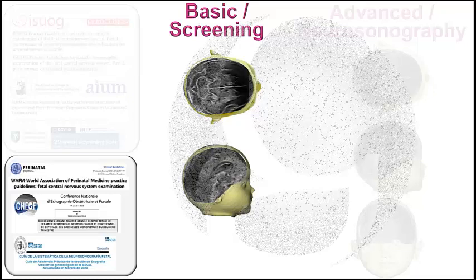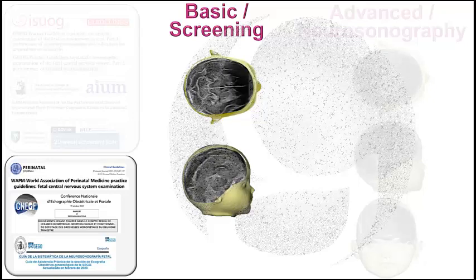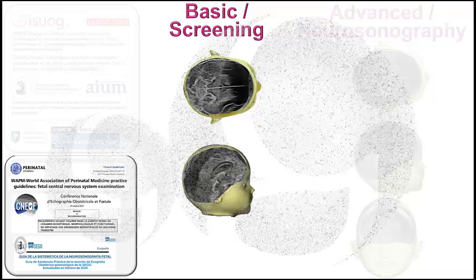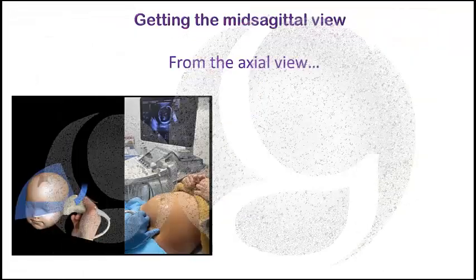The reason for not including the sagittal planes in the routine exam is that it is difficult to obtain and it requires expertise for interpreting it. I think that once you know how to achieve it, it is not difficult to get in most cases, and regarding the expertise, you won't progress and get experience if you do not even try to get it.